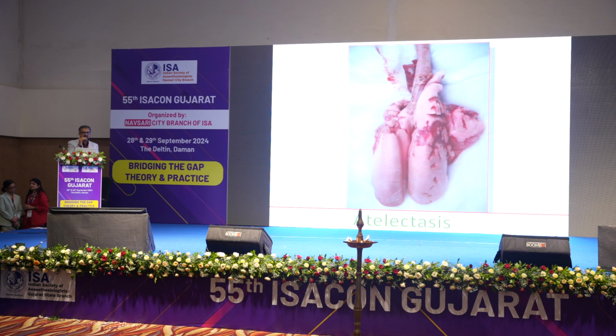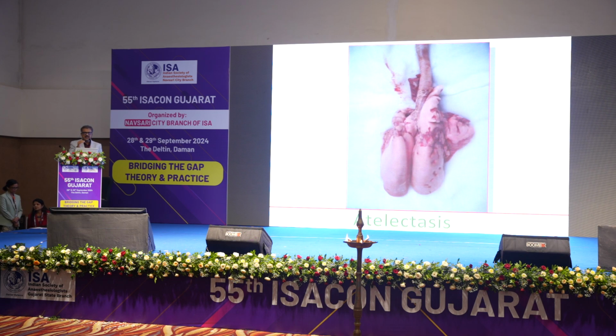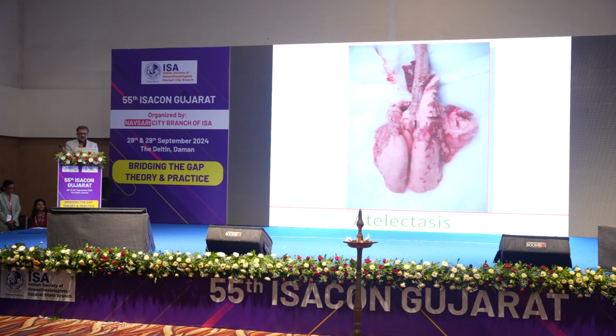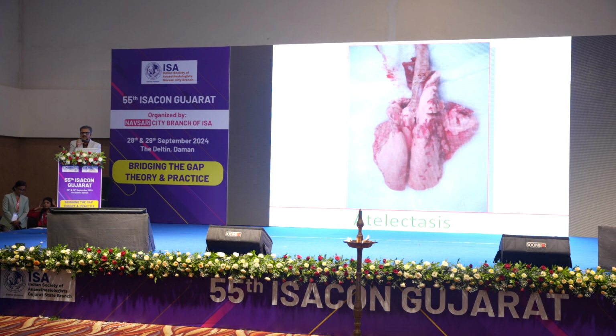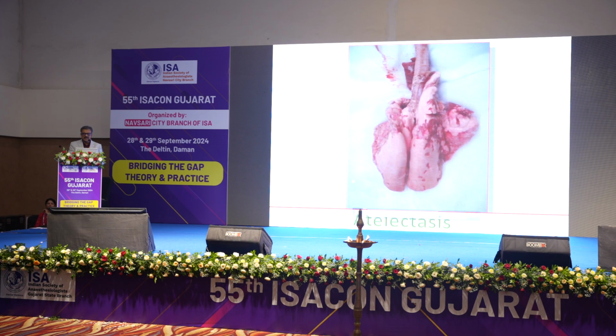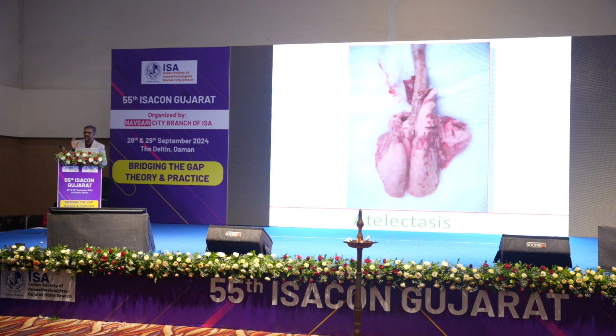And the amount of atelectasis depends on how high FiO2 you are using and how long you are using high FiO2. Another thing, the atelectasis development rate is from 4 to 21% of the lung volume. If you look at this video, almost 25% of lung is not ventilated.